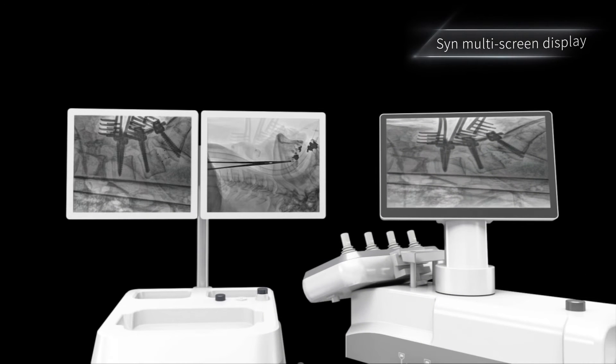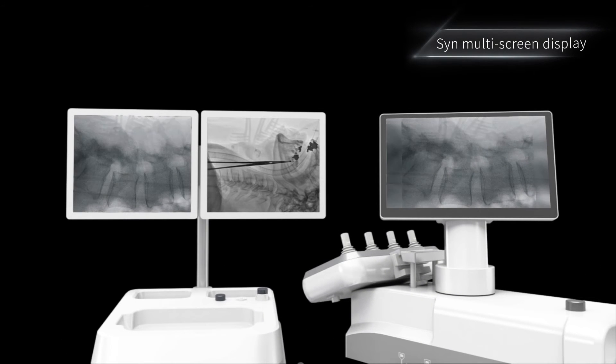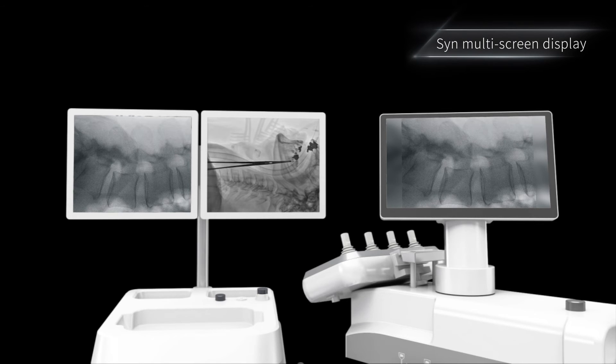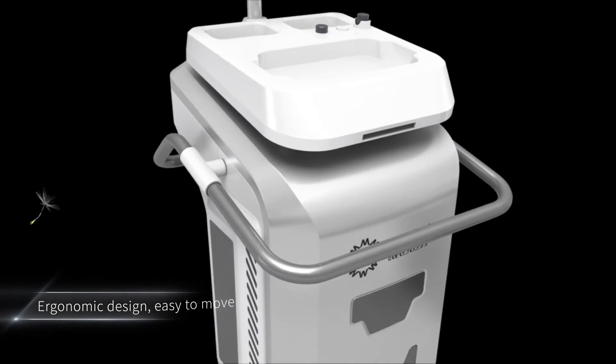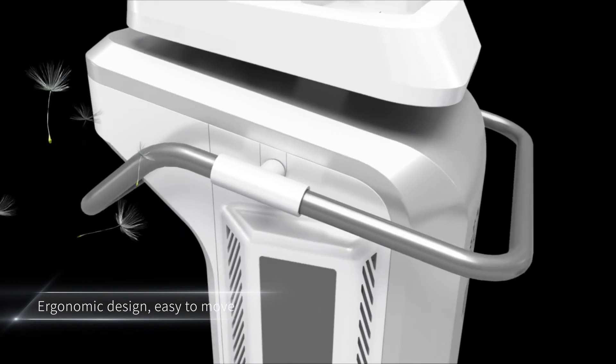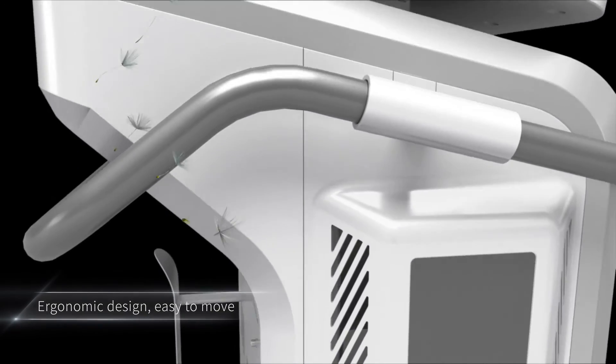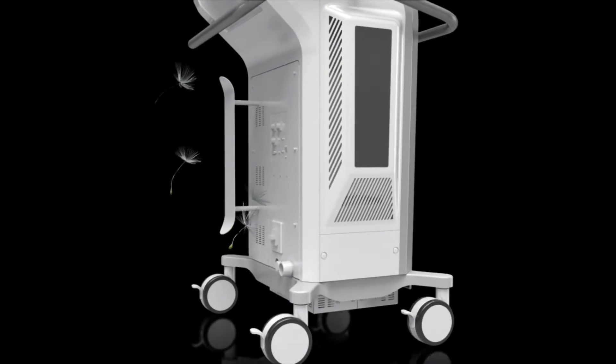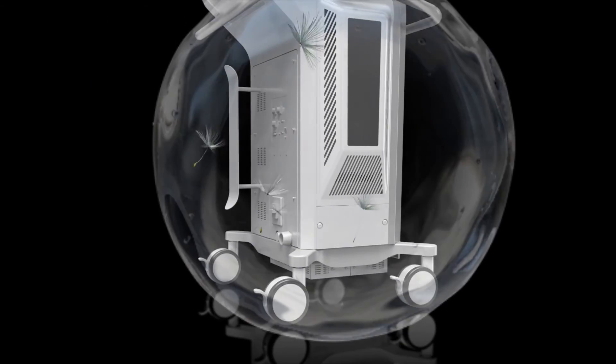Synchronized display enables simultaneous display of exposure images inside and outside the operating room for multiple-angle observation. Ergonomic design makes equipment movement easy to realize.